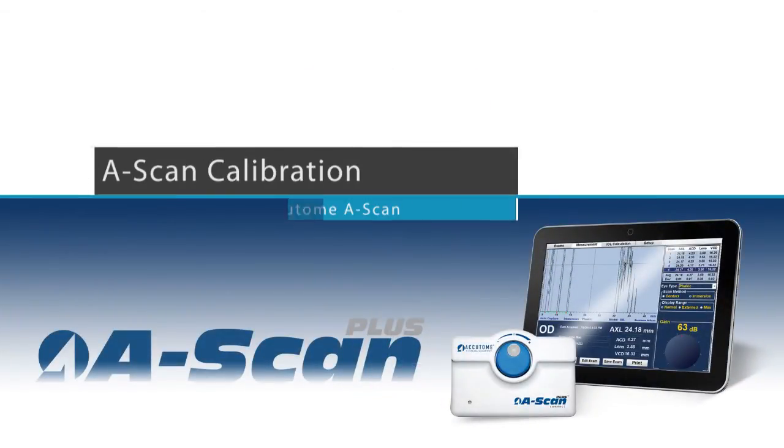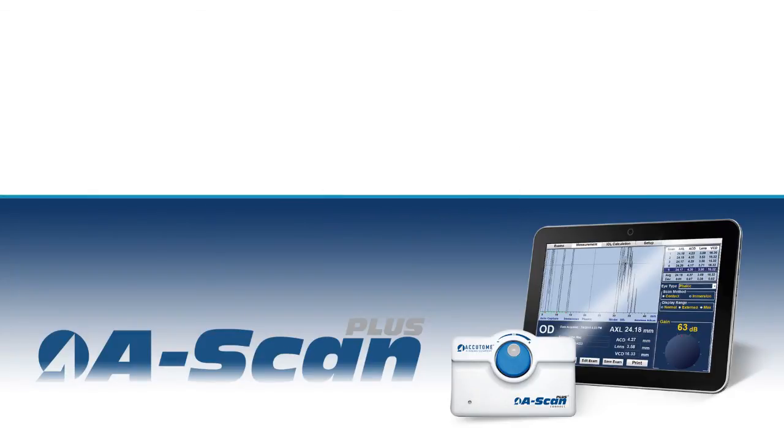Calibration. The Accutome A-scan does not require any calibration.